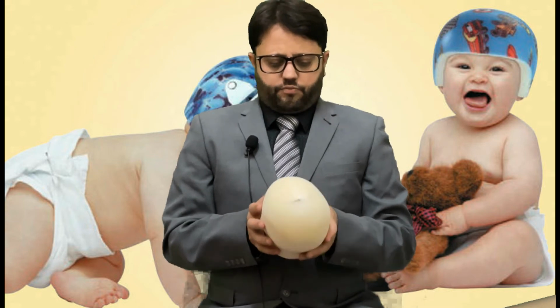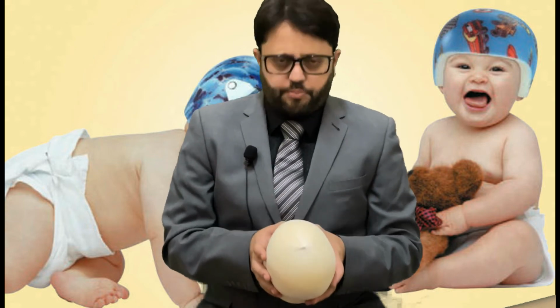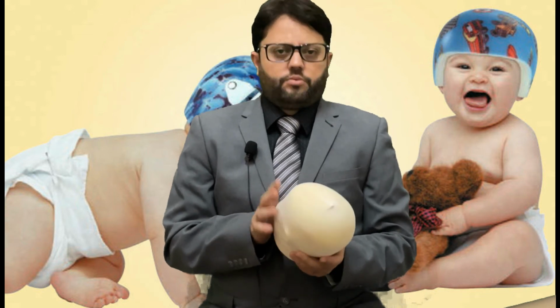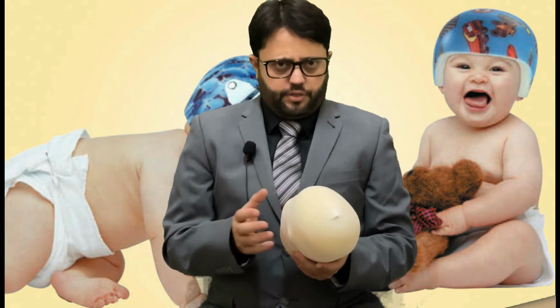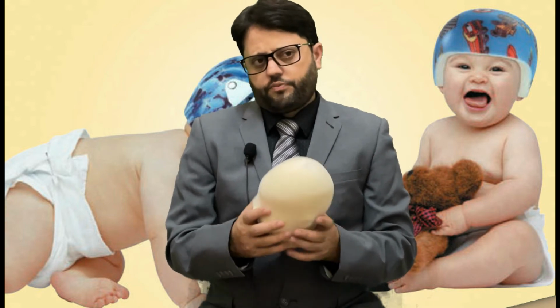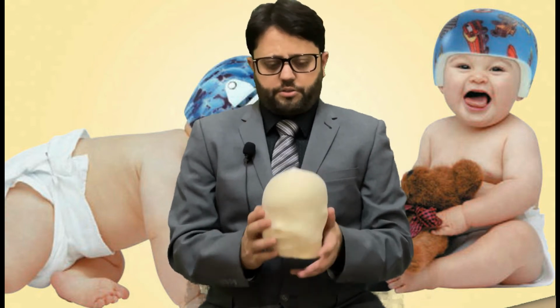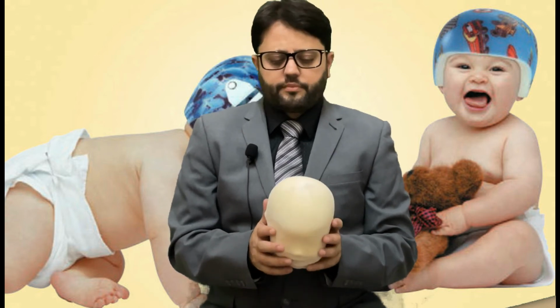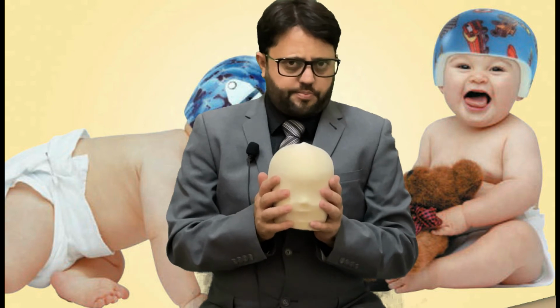How will we deal with this? Once the patient is with a pediatrician or any doctor, he will refer the patient to an orthotist. If he has enough awareness about the field, that we have something we can call a cranial remolding orthosis, we can really reshape the skull. Okay, what are our steps?